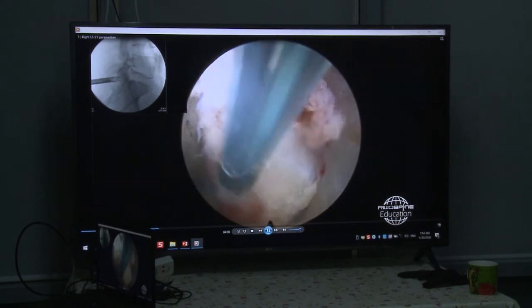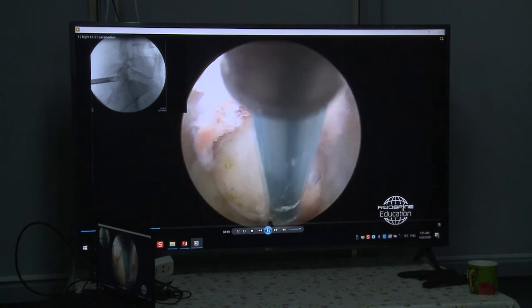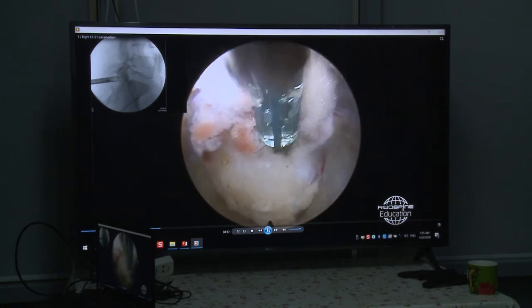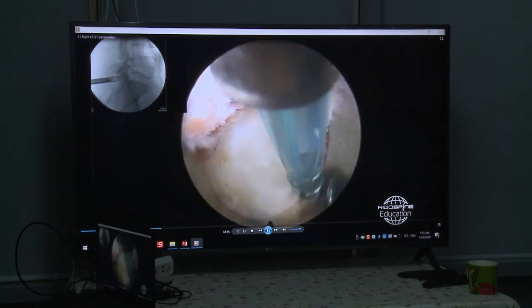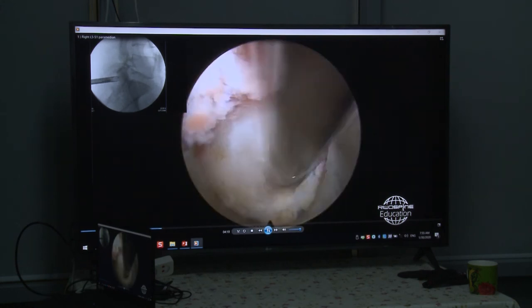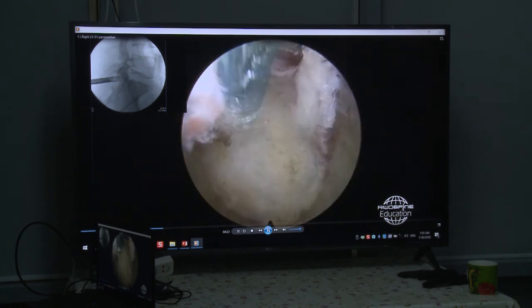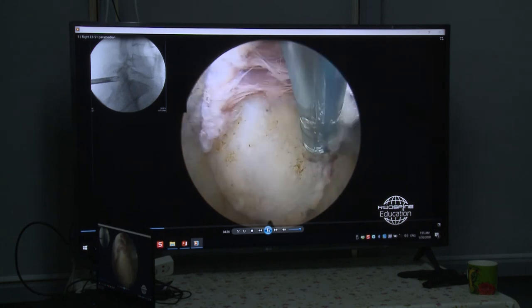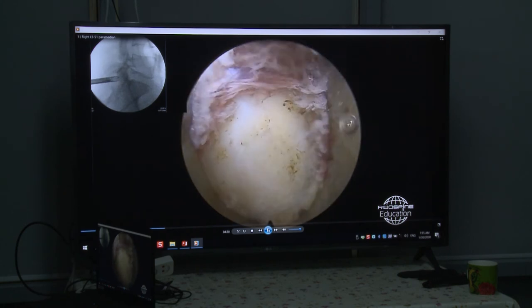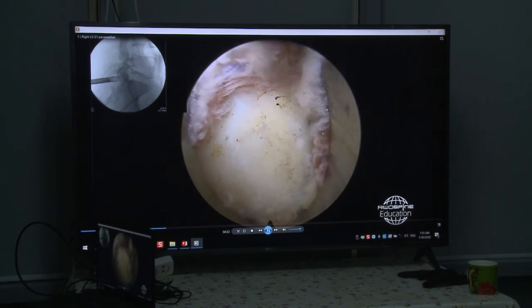So at 9 o'clock we have caudal. We operate on the right side. At 9 o'clock we have caudal, 3 o'clock cranial, 6 o'clock lateral. So it remains 12 o'clock, that's the medial. So that's the flavum ligament. We checked in the X-ray that our direction is correct, and then we start to open the flavum ligament.